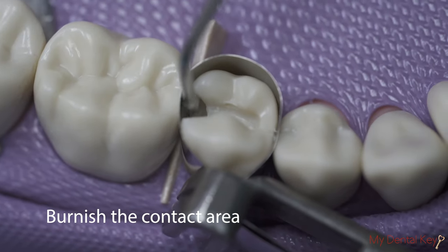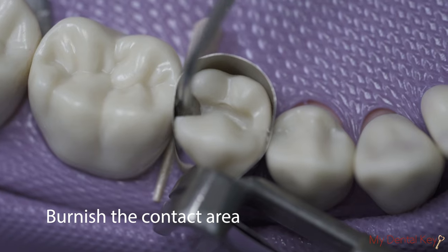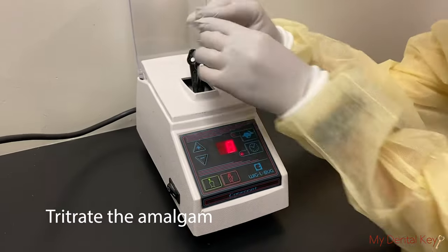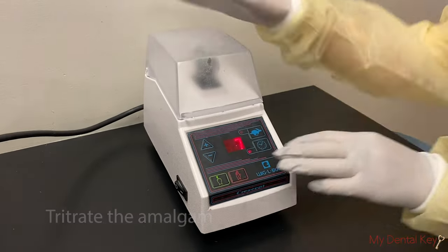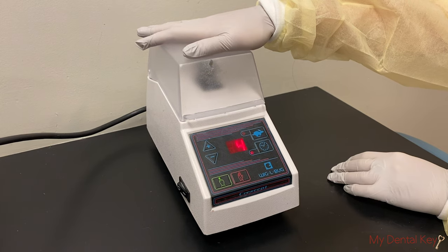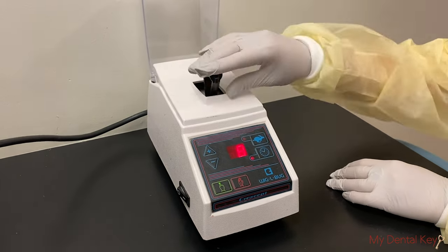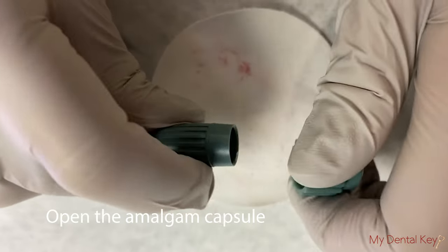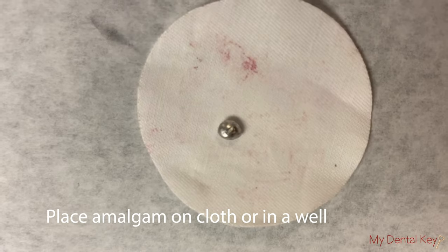Burnish the matrix band against the adjacent tooth in the contact area using your ball burnisher or amalgam condenser. Triturate the amalgam capsule for approximately 7 to 9 seconds, or according to the amalgam manufacturer's instructions. Properly triturated amalgam should have a homogenous consistency. Open the amalgam capsule and place the triturated amalgam into an amalgam well or onto a circular cloth.